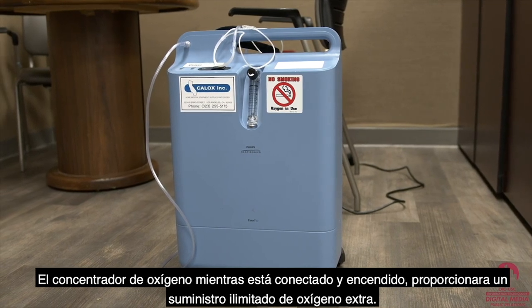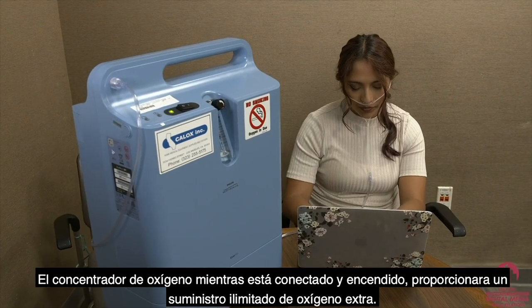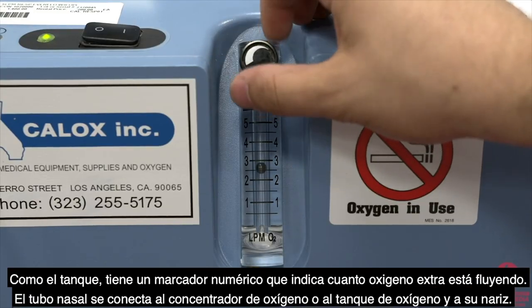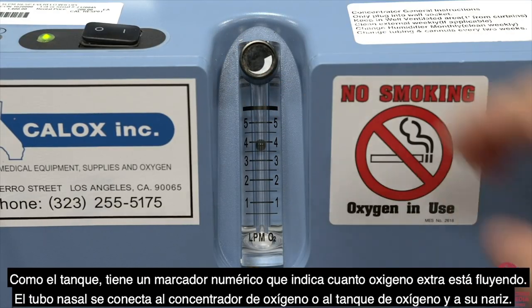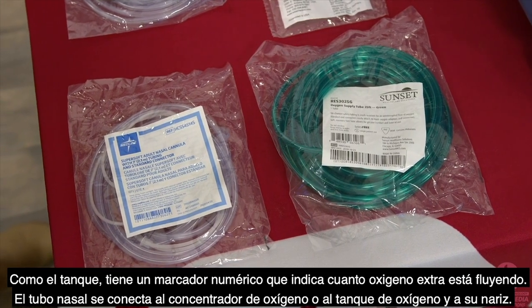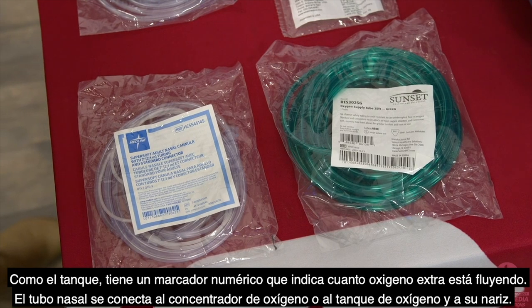The oxygen concentrator, when plugged in and turned on, provides an unlimited supply of extra oxygen. Like the tank, it contains a number dial which tells you how much extra oxygen is flowing. Nasal tubing connects from the oxygen concentrator or oxygen tank and into your nose.